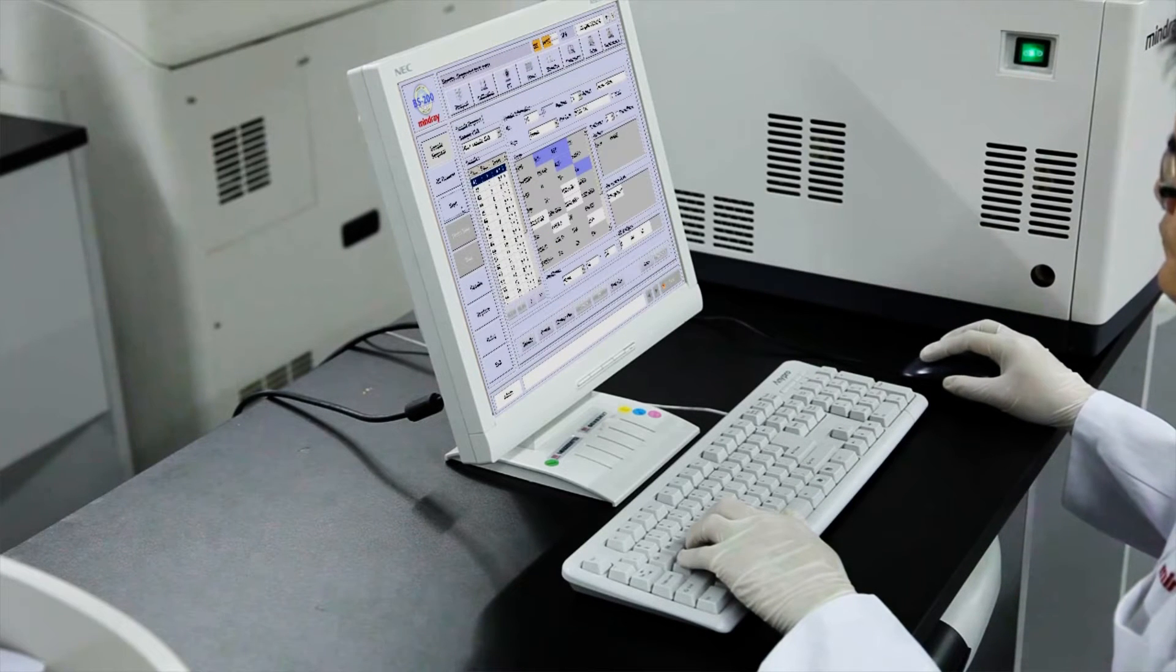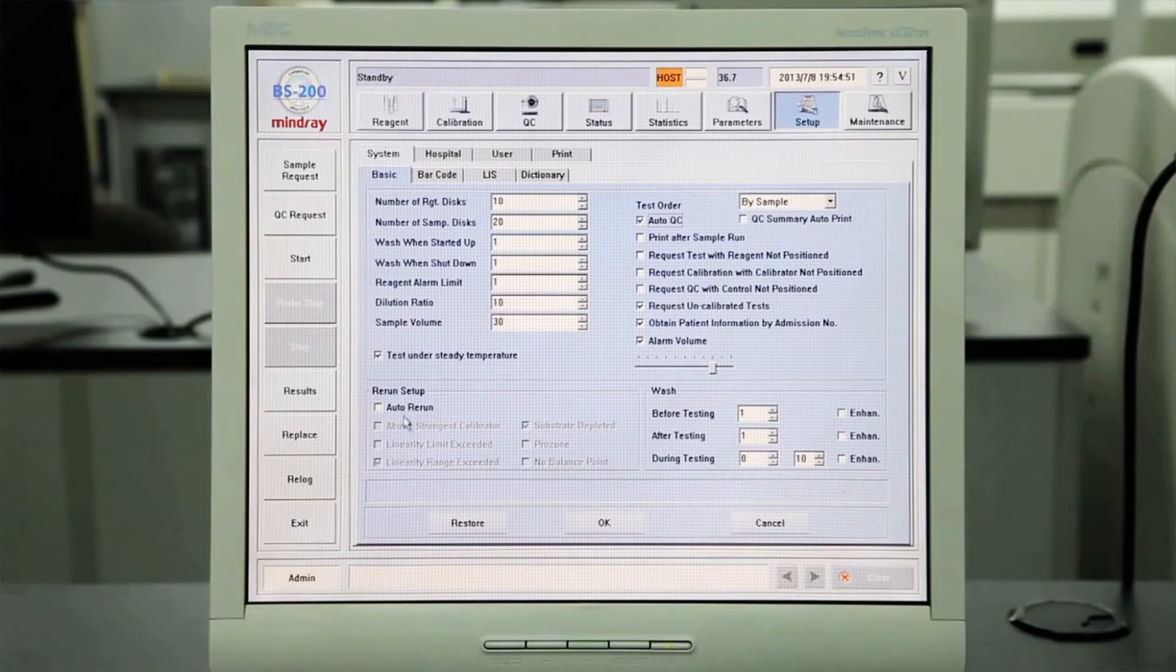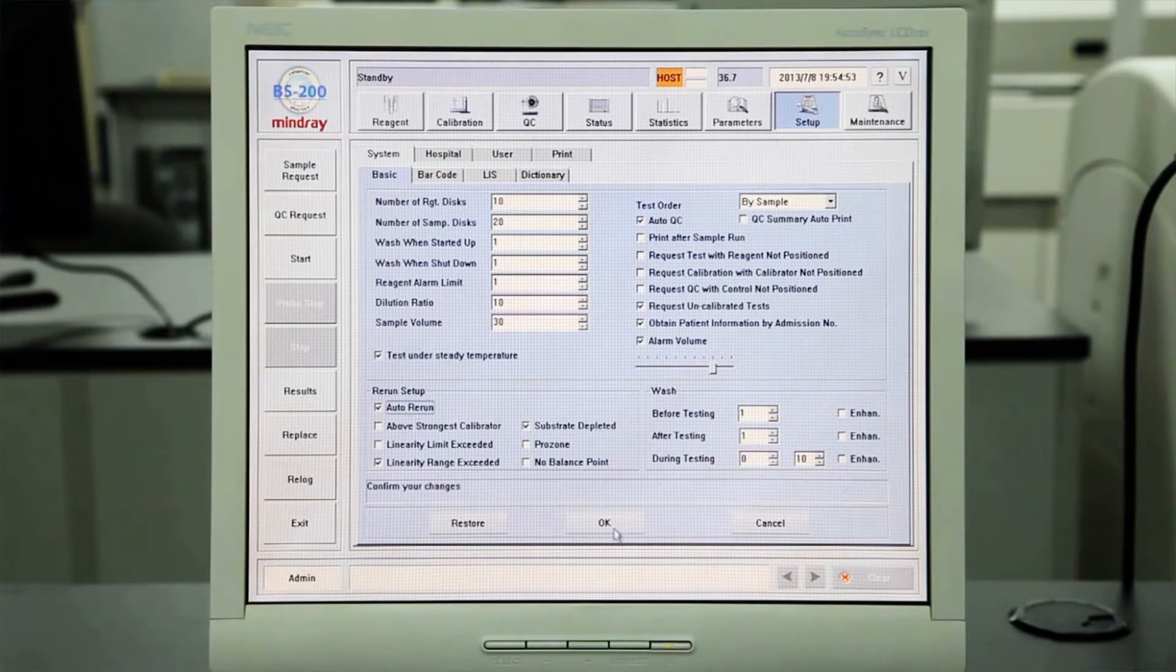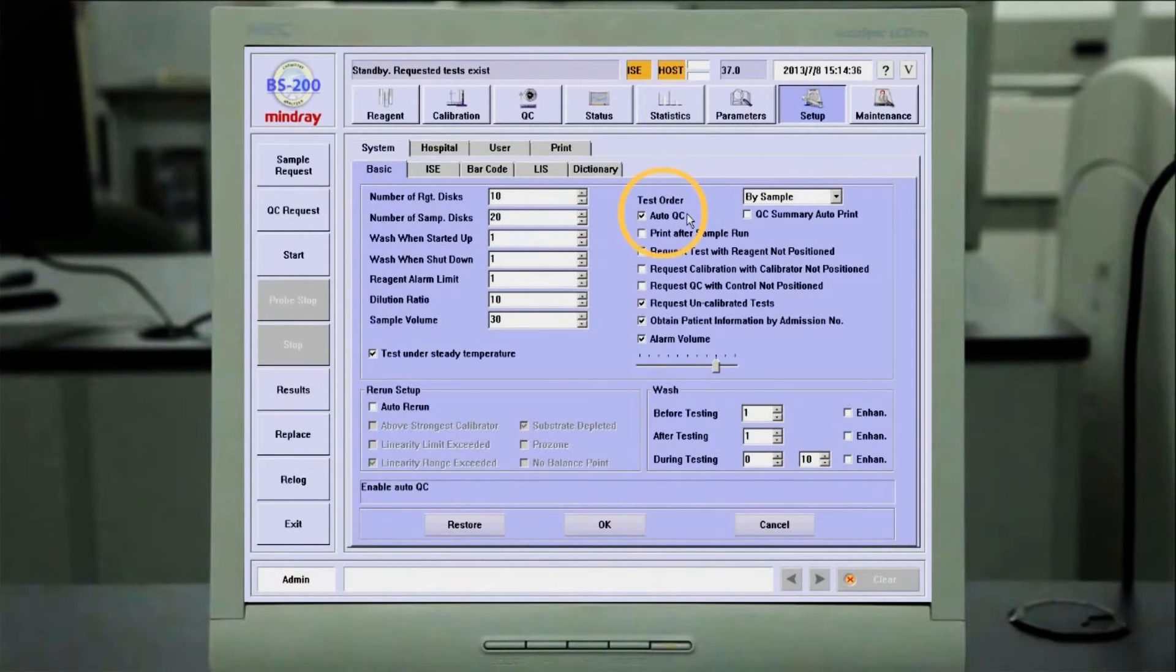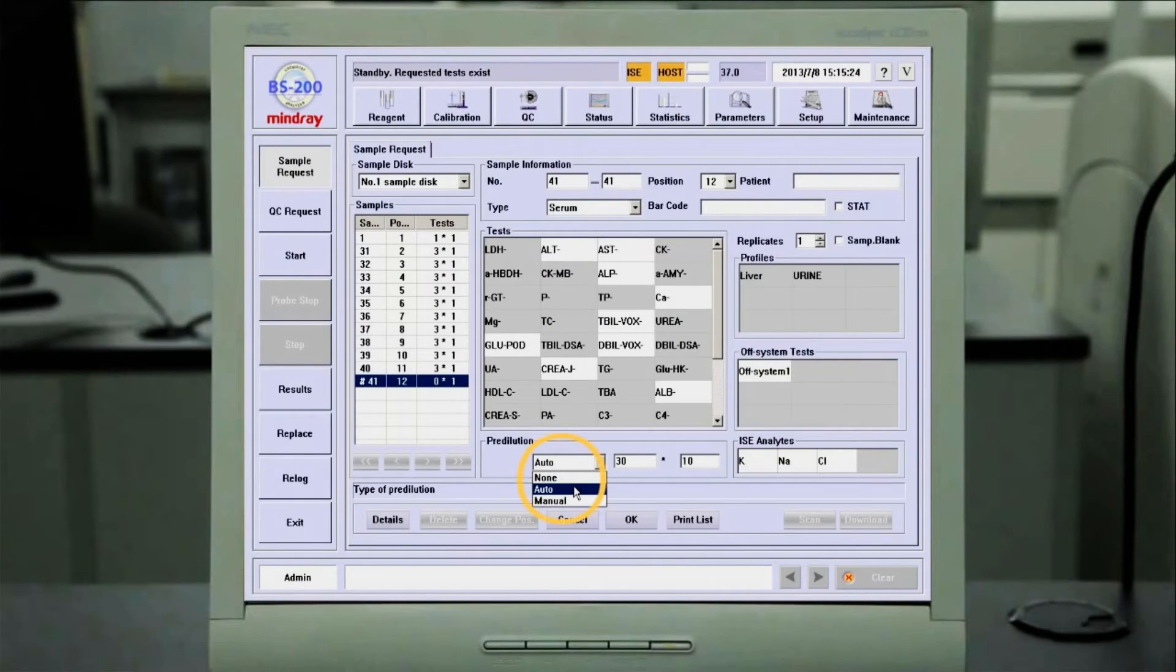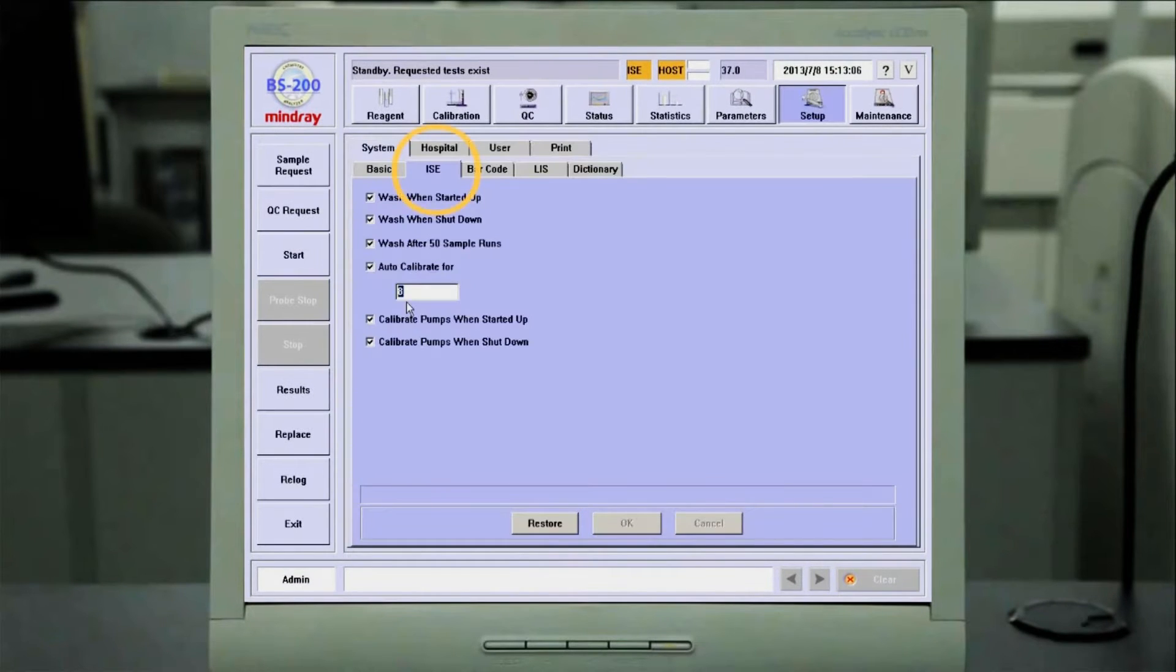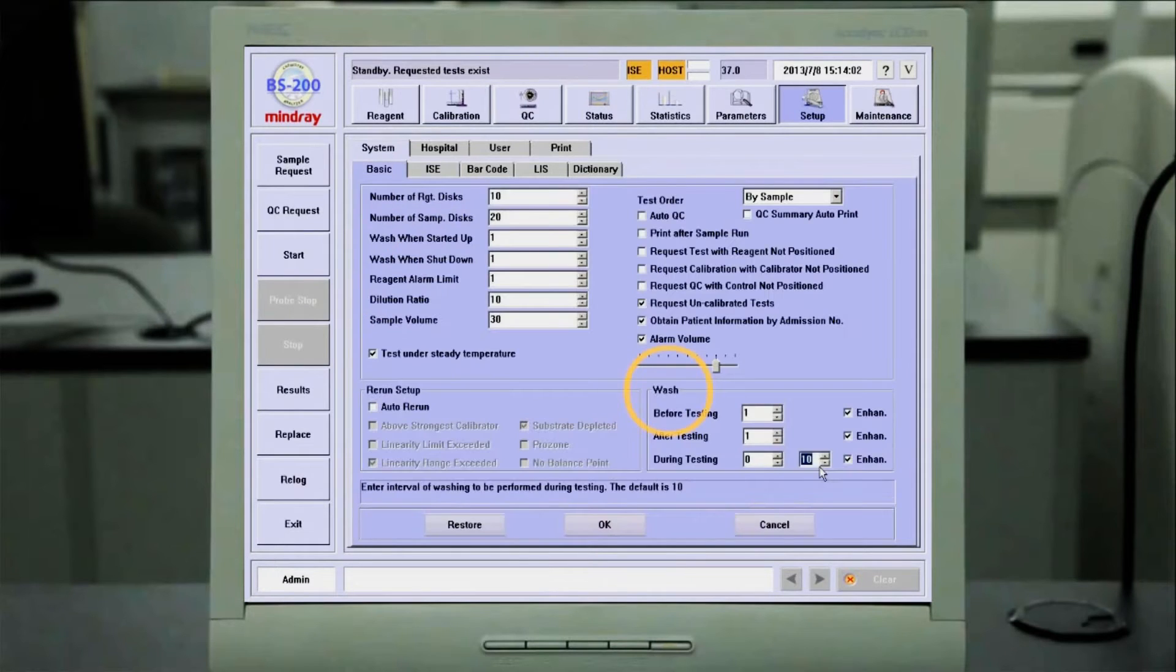the BS200 analyzer offers many high-quality functions typically found on high-volume central lab instruments. These functions are Auto-QC, Auto-Rerun, Auto-Pre-dilution, Auto-ISE Calibration, and Auto-Probe Cleaning.